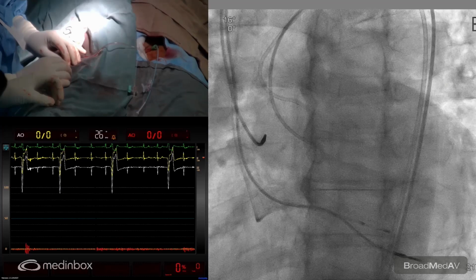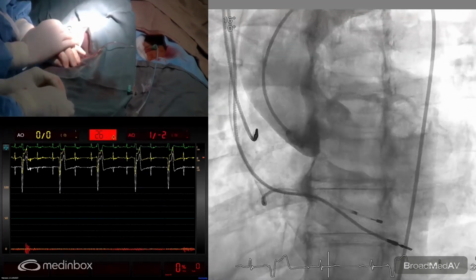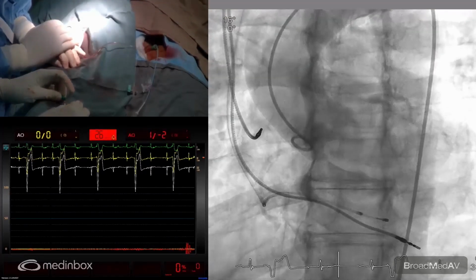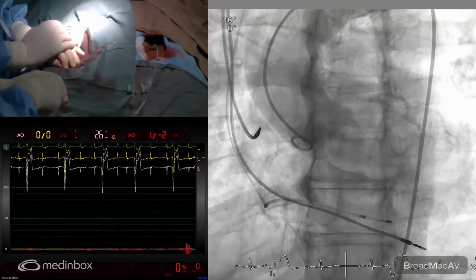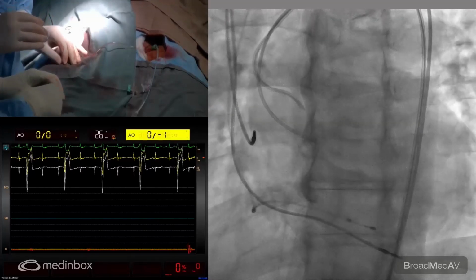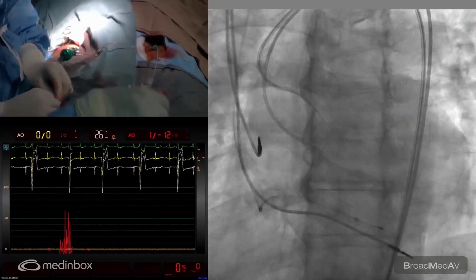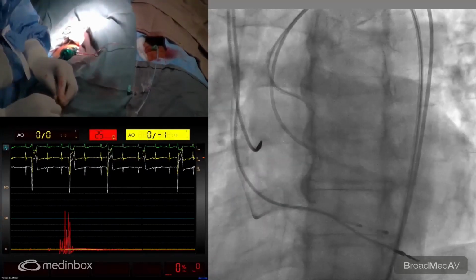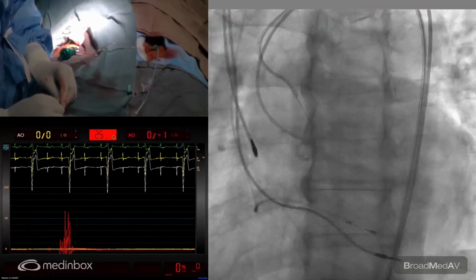Could you play the last shot? On coronary alignment, we do not necessarily need to wait till 1 month to see the CT. Even at the end of this case, we can show it in some of the fluoroscopic views also. Best, I think, in the cusp overlap view, if we take the shot we can see how the commissures are aligned or not. In this particular Myval, there is a marker at every commissure, where instead of one frame we can see two frames. So we can easily see the commissures after the deployment, even in the fluoroscopy. Let's see how it gets aligned in the fluoroscopy at the end of this case.